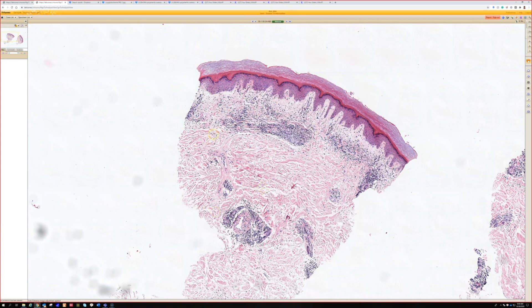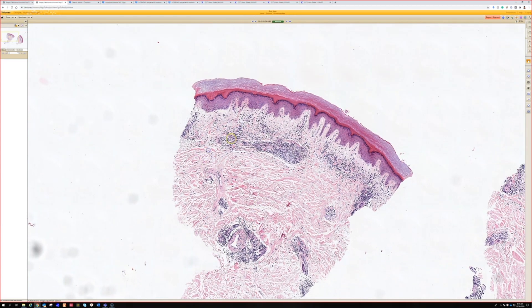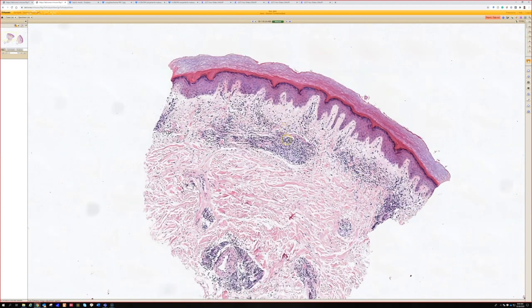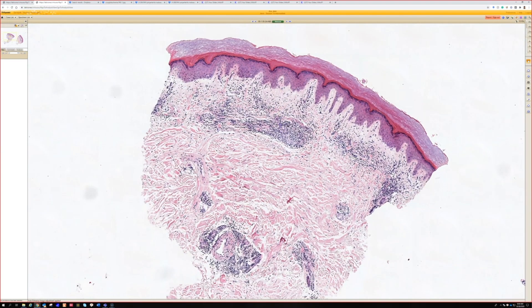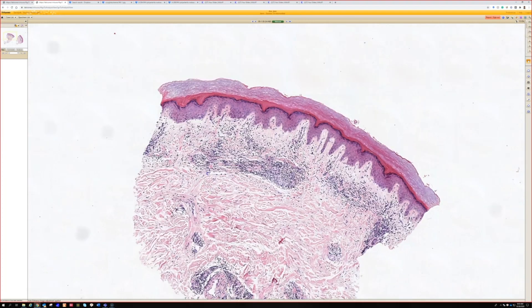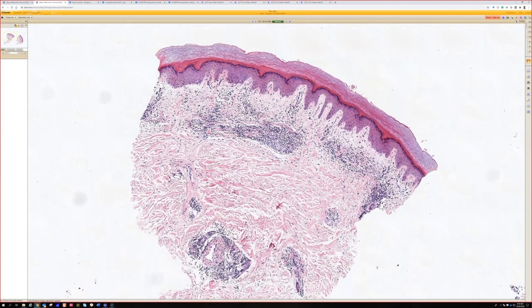If you put this same pattern somewhere else — not on acral skin — what would you think? Edema and superficial and deep lymphocytes kind of looks like PMLE, polymorphous light eruption. It can look like this.